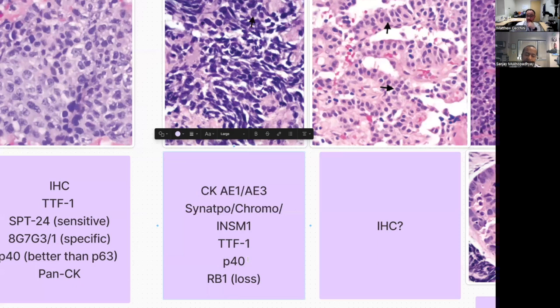Yeah. I don't know, you don't do Ki67 in these? I don't, Matt, for the reason that I mentioned. In the borderline cases, I feel I have to go back to morphology anyways. But your point about if you don't see mitosis and necrosis is a very, very good point. Actually, you should doubt a diagnosis of small cell if you cannot prove that it is high grade on morphology. And I think that's a good reason to use Ki67.